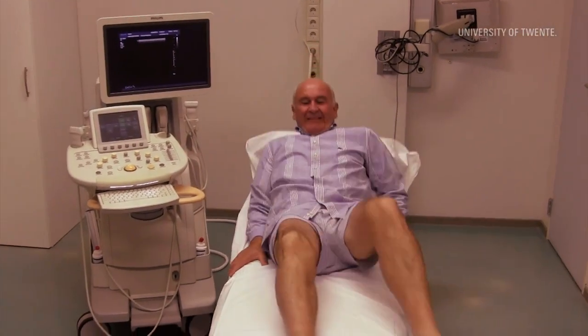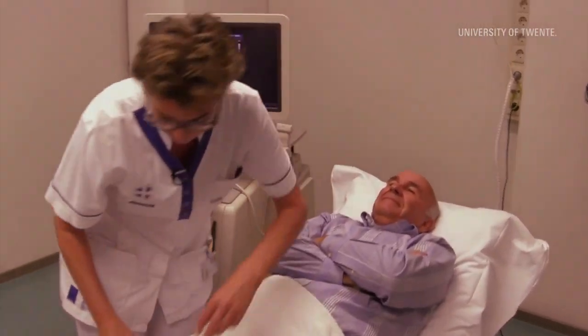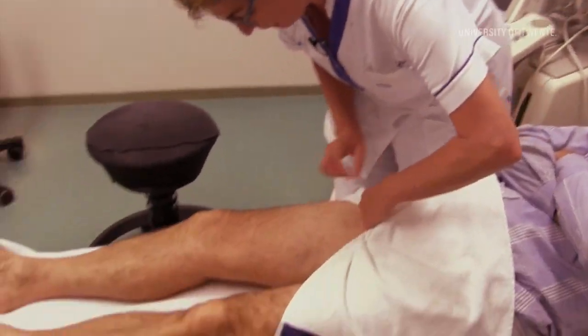We are now going to visit our vascular lab where we will meet our patient. For the last few weeks he has had pain in his leg after walking. His general practitioner referred him to the Department of Vascular Surgery with a suspicion of intermittent claudication due to occlusive disease in the lower limb arteries. We decided to perform a duplex ultrasound examination with specific interest for the arteries in the lower limb.